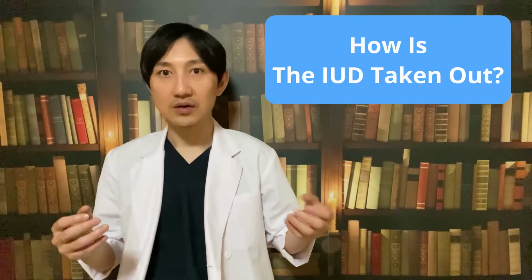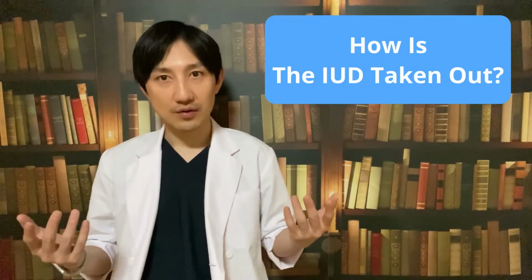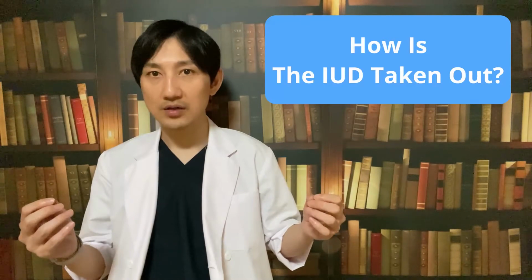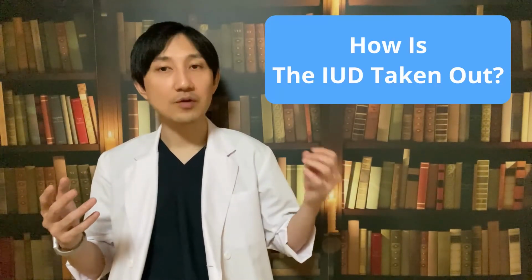Okay, next. How is the IUD taken out? You need to go to the doctor to take the IUD out. They will gently pull on the threads to remove it and then talk to you about your options going forward, for example, having a new IUD fitted or using some other form of contraception.